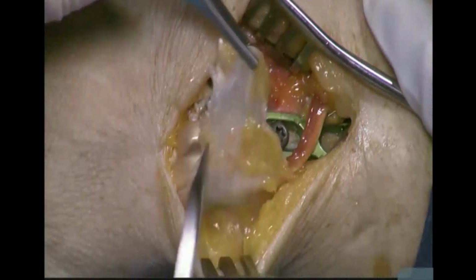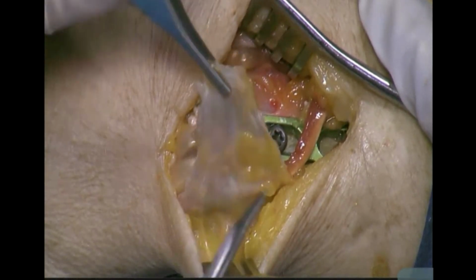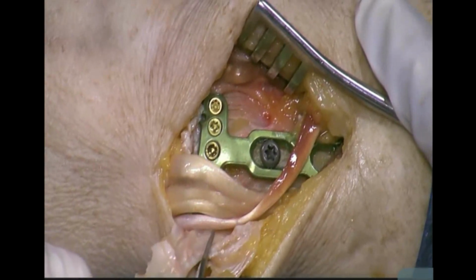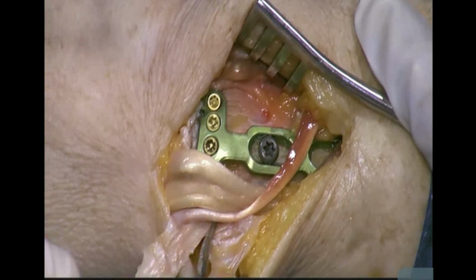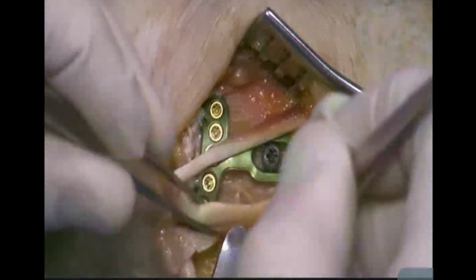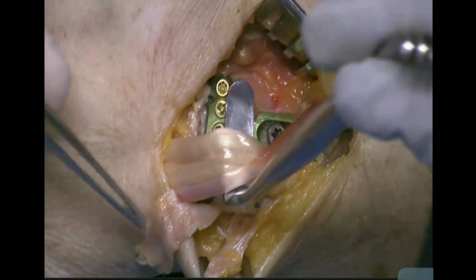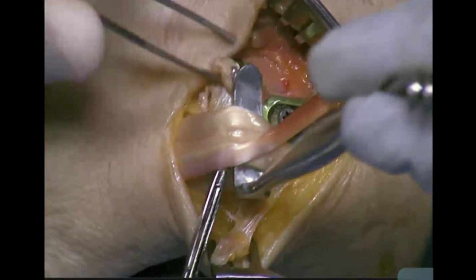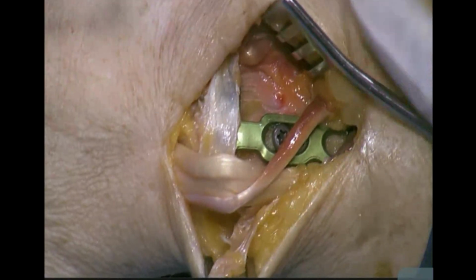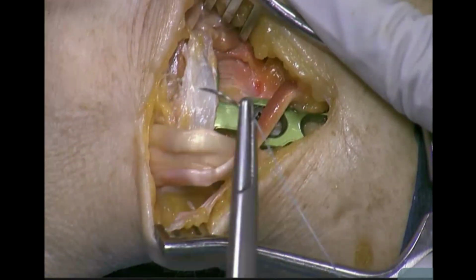So the retinaculum, we save this as a wide flap because I'm going to use the distal portion of the flap to help with my plate and try and minimize our risk of tendon irritation. So I'm going to divide this all the way down to the floor between the first and the second compartments. Then the tendons of the second are raised up. This retinacular flap is passed through, and now these tendons can retract out of the way. And we'll proceed with closure over here.